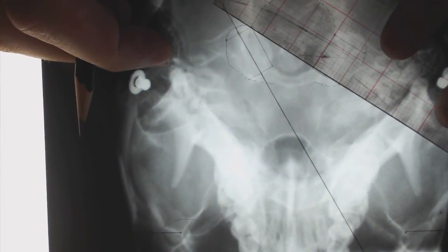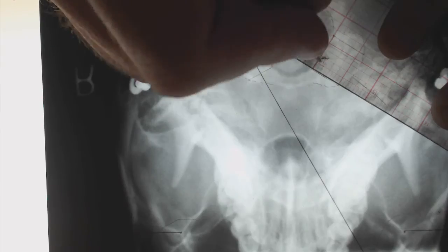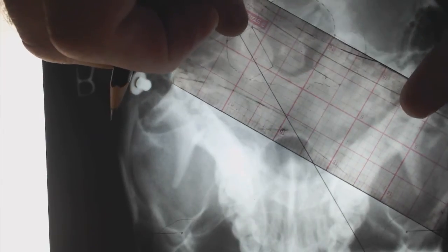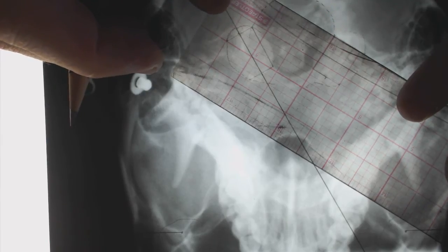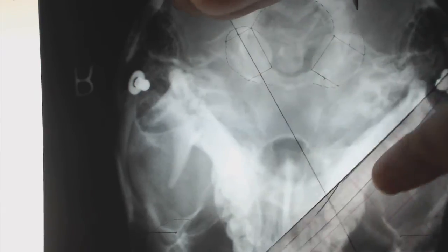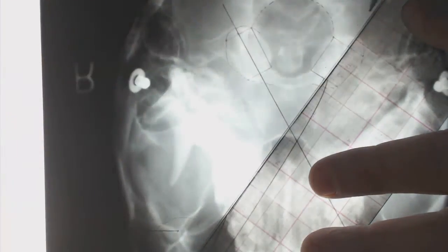We're going to come over to the left joint and bisect that line. Measuring: eight millimeters, so half is four — make a dot. Then bisect our last line: nine millimeters, so four and a half. You'll notice these are not going to be always the same on both lines because the joints are different. Connect these two dots — there's our left convergence angle.